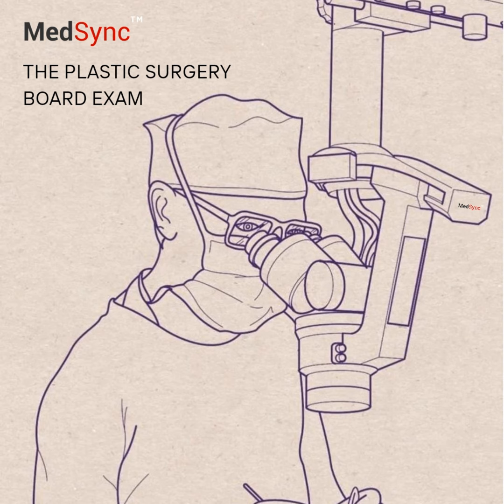Well, some things are expected, like purpura after pulse dye laser. But true complications include post-inflammatory hyperpigmentation, PIH. PIH is quite common. Yes, especially in darker skin types or with recent sun exposure. It typically appears weeks to months after treatment, maybe 6 weeks to 6 months, and usually fades over time. Hydroquinone can help treat it.